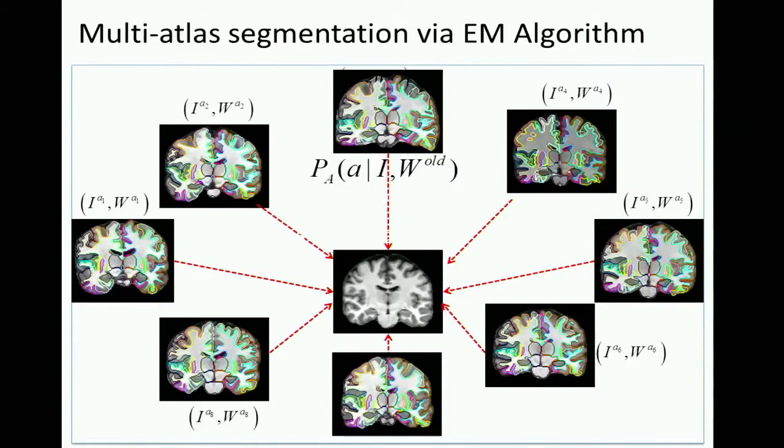Again, I can see the common theme of knowledge versus one individual. Basically, we prepare a large number of fully segmented atlases. Now we have, at this moment, 86 atlases aged from 4 to 90 years old. And when a patient comes, one of the most obvious ways is to pick about 10 atlases based on the age and use this knowledge to come up with the best estimation of where the structure is. For example, here is a thalamus, and this atlas casts this information onto this patient and has an opinion about where the thalamus is. In this case, we have 8 opinions about where the thalamus is, and then we have to have some kind of arbitration process to get the best guess.